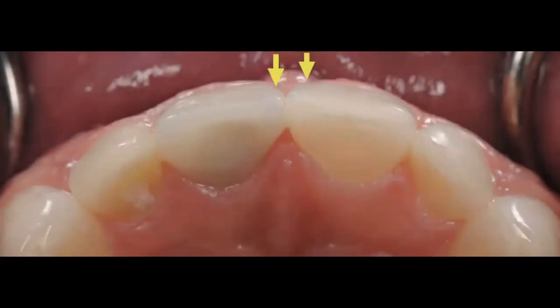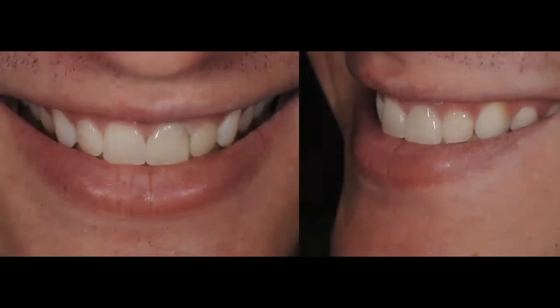You can see this better from the incisal view. You can see the grayish appearance of the ceramic here. But look at the lack of the line angle. Look at this line angle here. Look how nice and thick the line angle is naturally on this tooth number 8. And look at the lack of it on tooth number 9. So that's why this tooth appeared to be very flat and wide, because it was lacking a good, thick line angle. So again, this for me was going to be a redo, and that's what we decided to do.